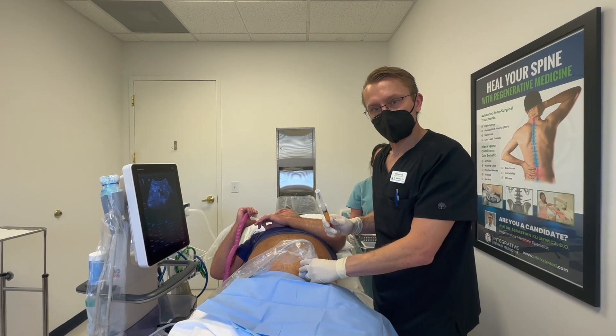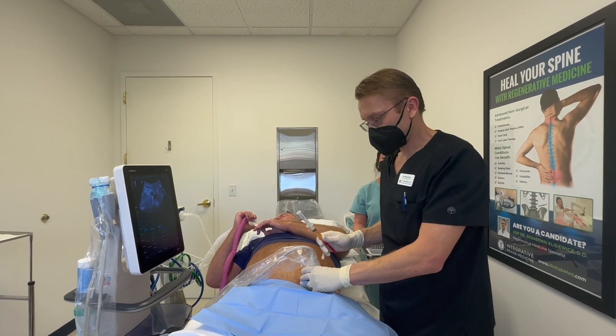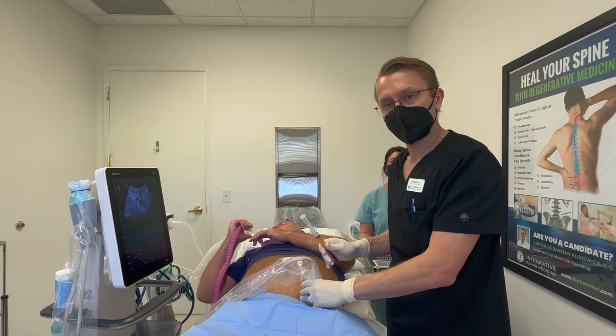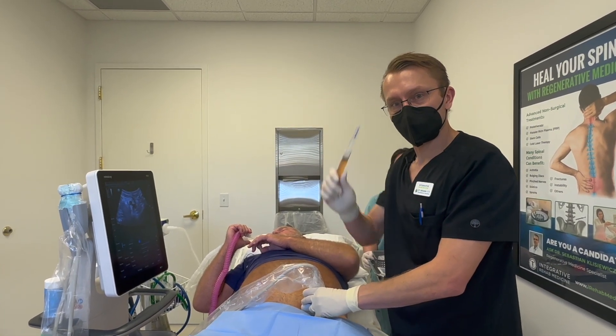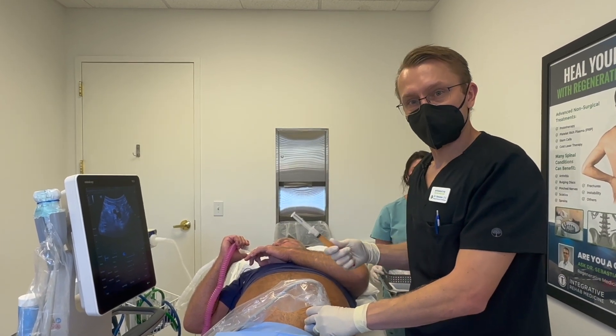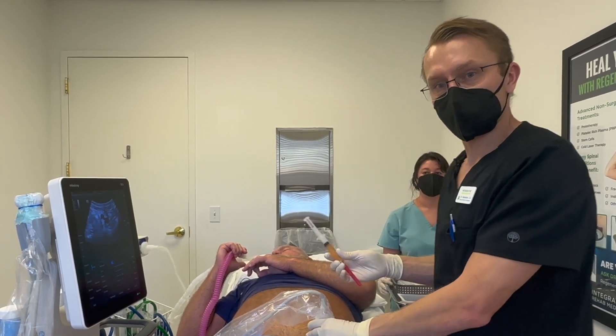For the best treatment of the hip joint, we have to treat all the surrounding tendons and ligaments. He has some other injuries to the adductors and some of the hip flexors, so we're going to use some PRP with a little bit of lysate as well and inject those areas. That's going to help stimulate the healing and protect the joint while it's healing from the bone marrow stem cells.